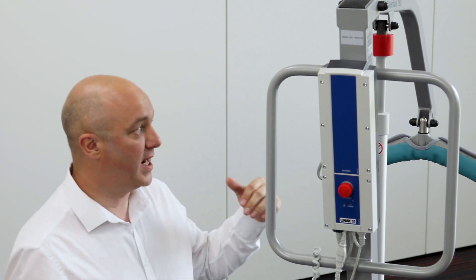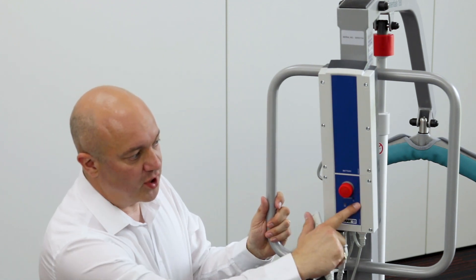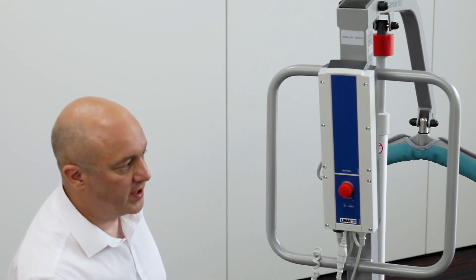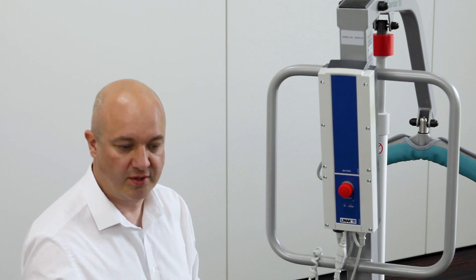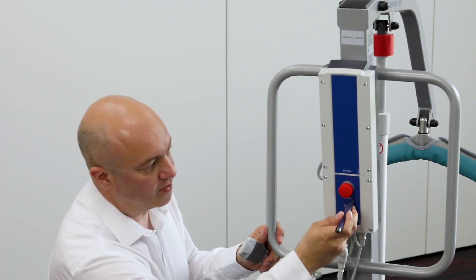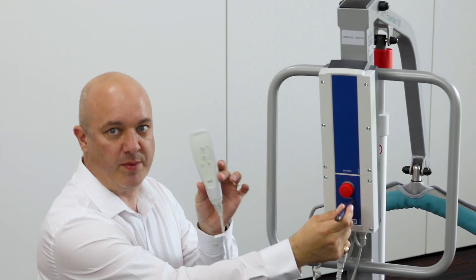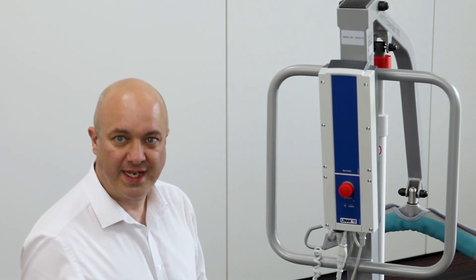Now if for some reason the handset was to stop working — the client has a dog that chews it, you run over the cable, whatever happens — if you damage it and you've got somebody up in the air, there is an emergency override underneath the emergency stop switch. It says emergency, there's a down arrow and a little hole. If I get a pen and pop it into that hole, it will actually operate the down switch without pressing the handset, so you've always got a method of getting somebody down again.